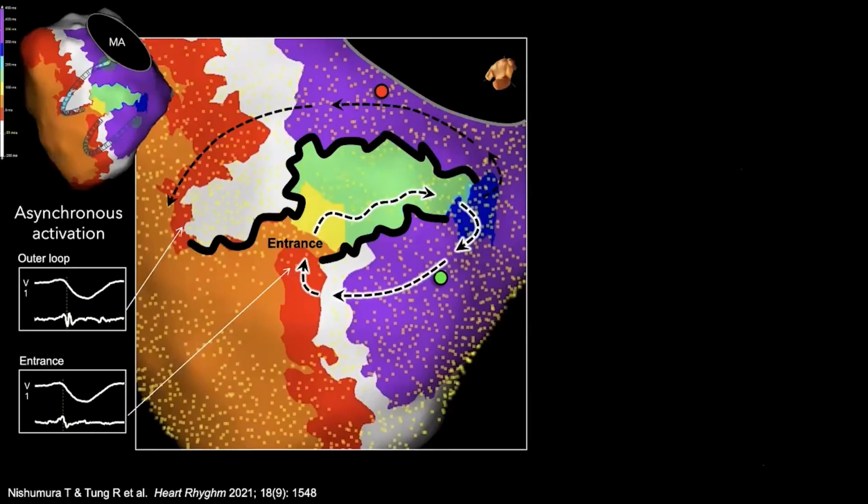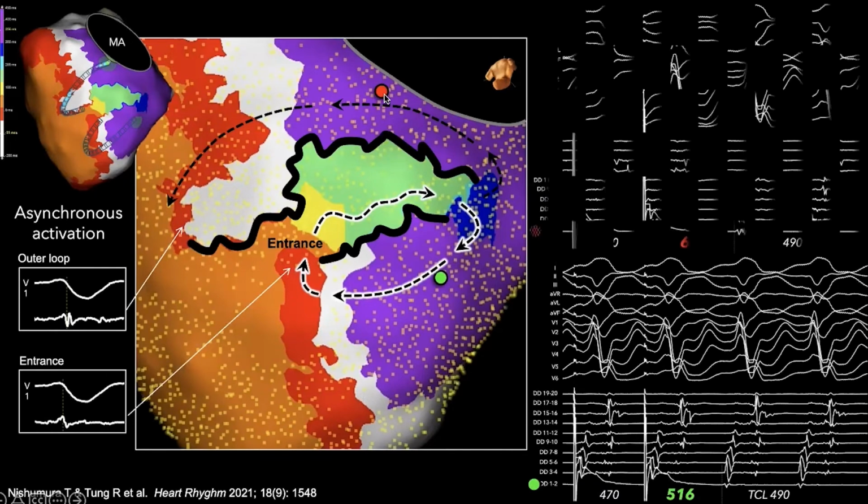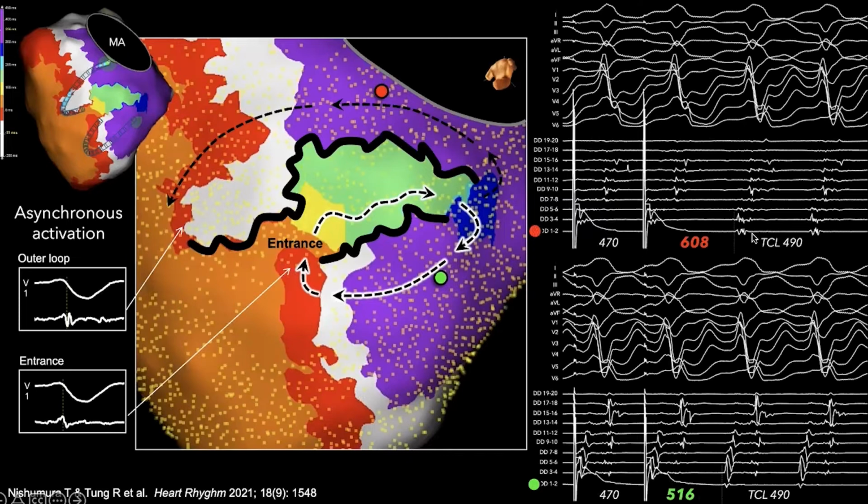We've also tried to question the status quo, and with a dual loop tachycardia, looking at whether the double loop reentry is indeed the mechanism or if it's actually just the appearance or the pattern. Here you can see we did entrainment at the lower outer loop, and this is an in-circuit response, whereas if we entrain in the upper outer loop, we get an out-of-circuit response, which is quite beautiful.